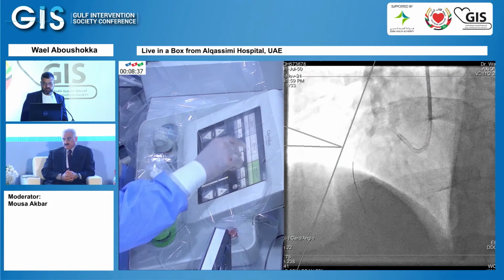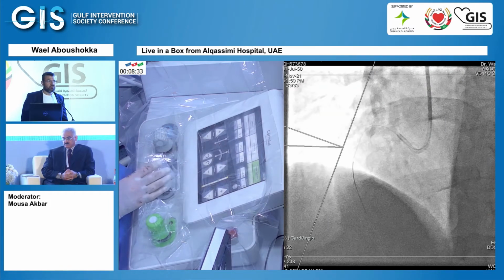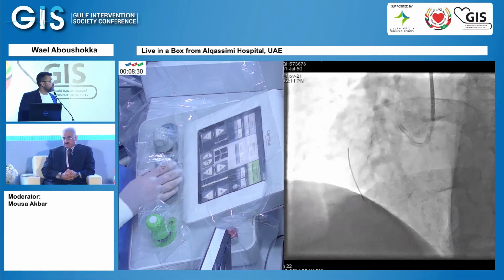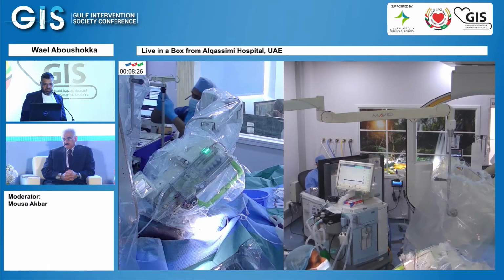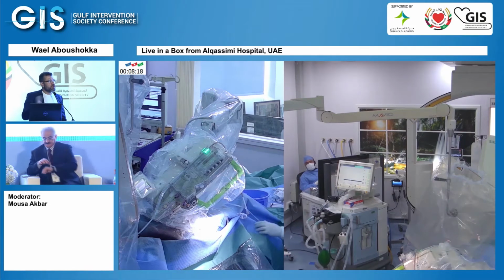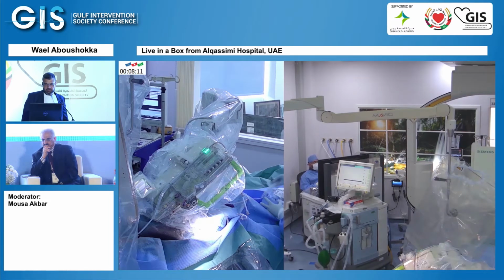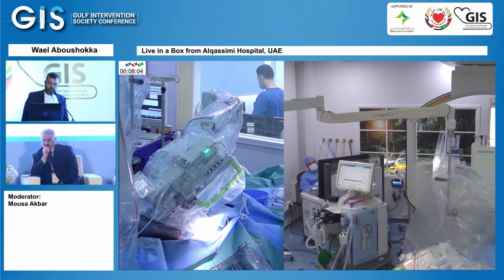So now we'll use the wiggle technique for guiding. You see how PA cranial the wiggle technique is. Okay, can you load a balloon on this? Now, a 2.0 balloon fast, please. Our wire is stuck because it was such a tight stenosis in the RCA. So we'll dilate this gently, and then we'll put another wire in the PLA.